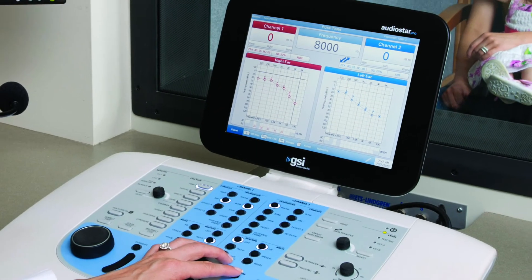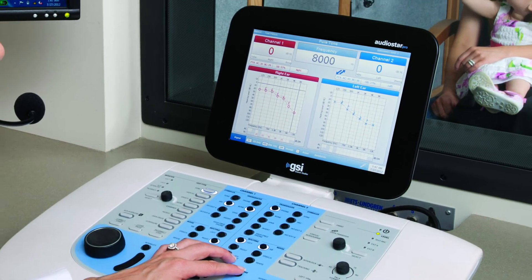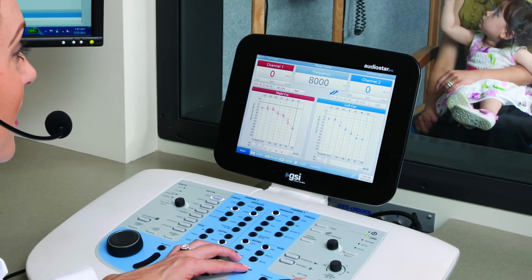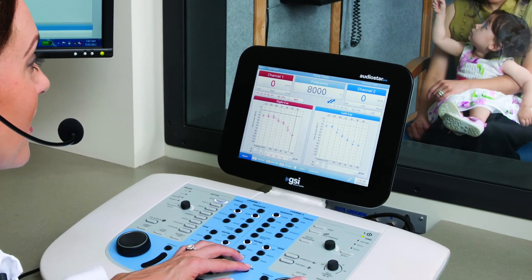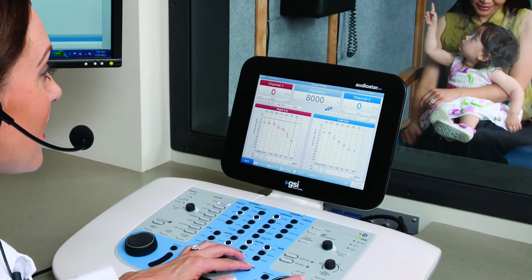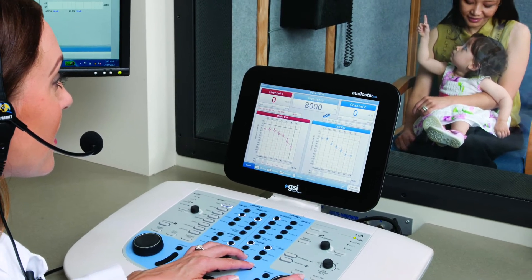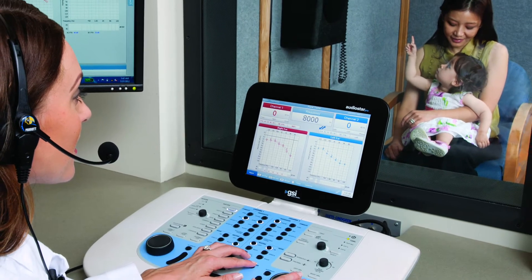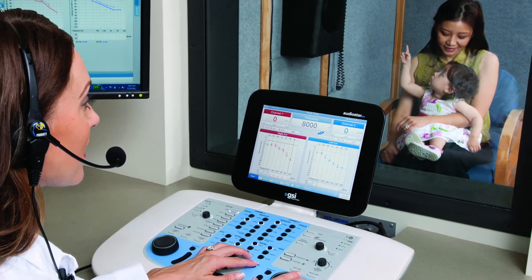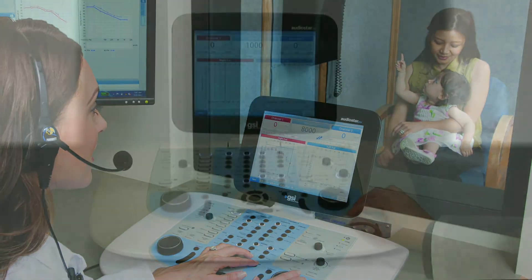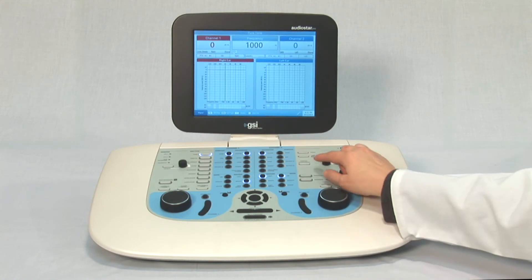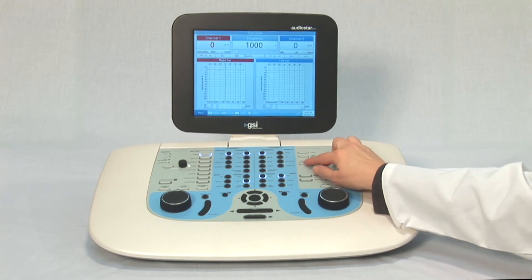When a more critical look at frequency-specific thresholds is required, it is possible to expand the frequencies available for testing on the AudioStar Pro. To access the wide range of options, press the Status Audiogram button on the front panel.